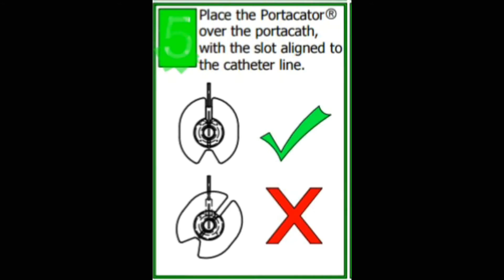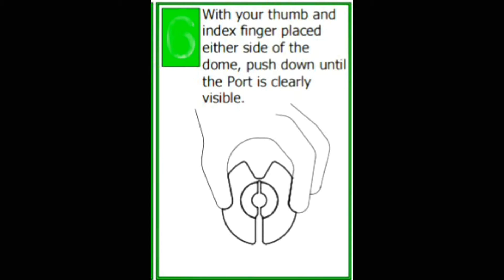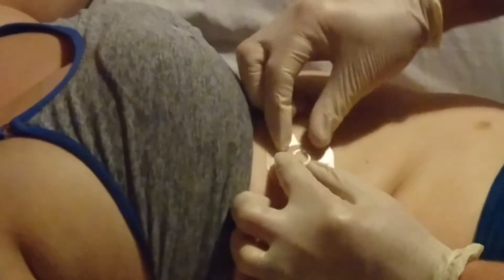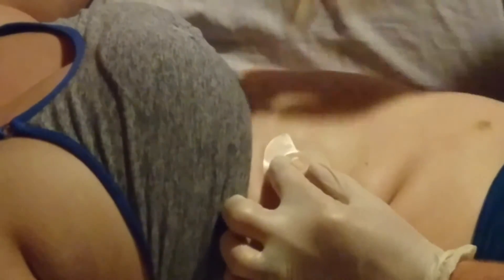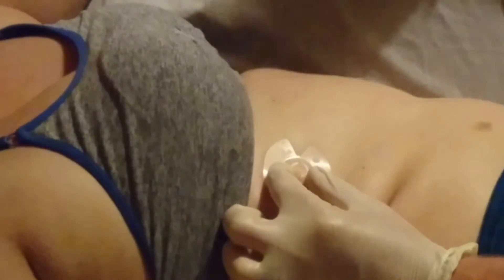Then you place the port-a-cater over the port-a-cath with the slot aligned with the exit of the port — shown here with the exit of the port in purple and the slot in green, correctly aligned. Then you place it over and hold down with two fingers, giving you maximum visibility and accessibility while still holding the port still ready for access.